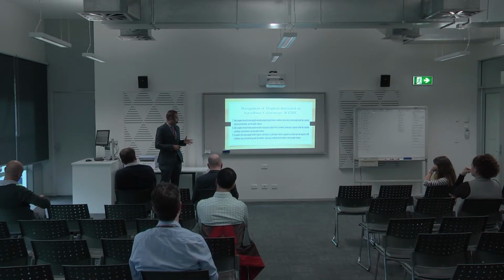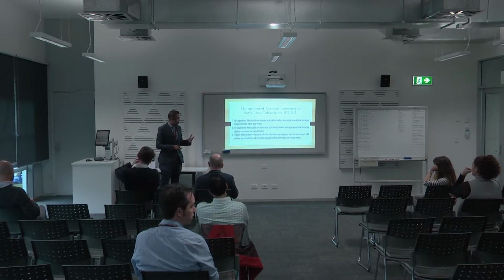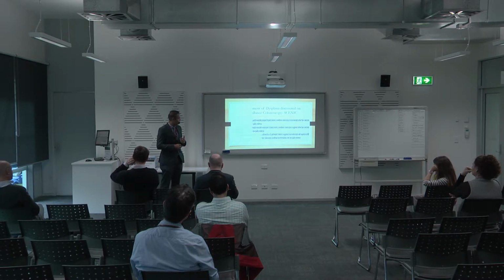And if the lesion was invisible, and that's more pertaining to standard colonoscopy, if you did pick it up, then it should be referred to a specialist who can do chromoendoscopy.